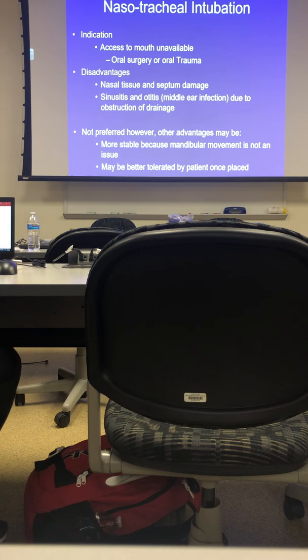Okay, so nasal tracheal intubation, we kind of talked about that a little bit, some of the disadvantages, sinusitis, it's more comfortable for the patient. Although we never nasally intubate if the patient has any kind of a head injury. So they were in a car accident, we don't know if they have a skull fracture or not. If they have a skull fracture and you put a tube in, you could put it into the brain. So we never nasally intubate. If there was any kind of a thought about having a head injury, we would orally intubate, okay?